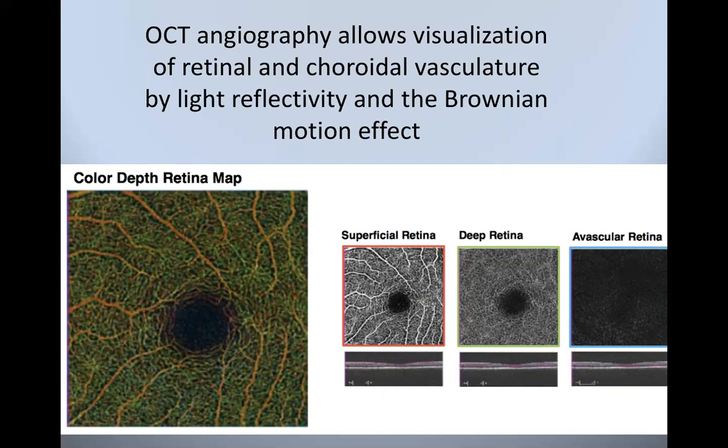And if you look at the superficial retina next to it, this is what we see in fluorescein angiography. We see the superficial vasculature of the retina. That fluorescence from that superficial vasculature masks any fluorescence underneath there in the deep retinal plexus. And remember, we're looking en face, essentially, with fluorescein angiography. So we're really only looking at the top surface of the eye. We can't see down underneath that because we can't penetrate with white light through those structures.